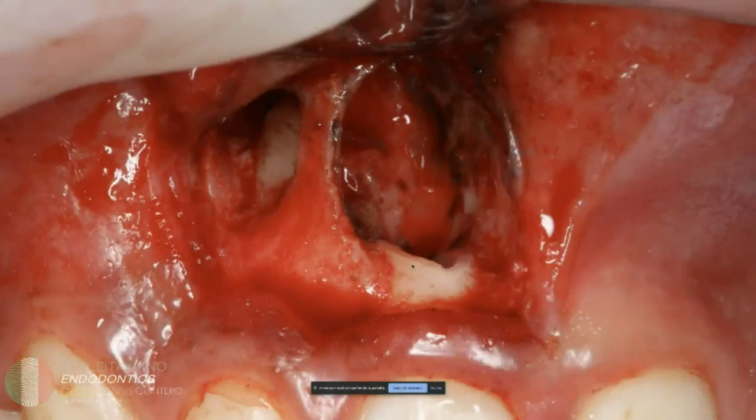to make a retreatment, because making a non-surgical treatment for me to do an apical plug there is difficult, because it's very irregular, it's very big, and also we have part of the root on the palatal side that has been resorbed, and I have to remove that because that can be a part where bacteria can be there and also keep the lesion growing more and more.